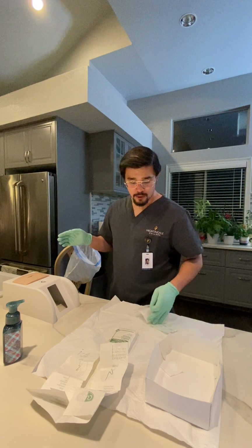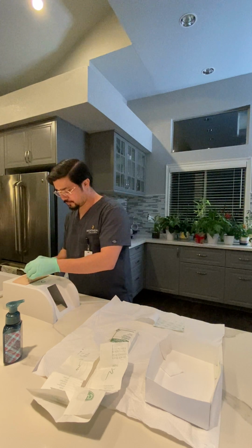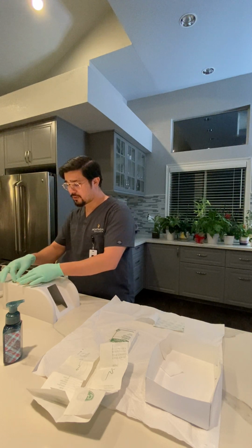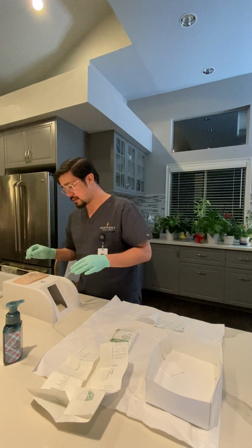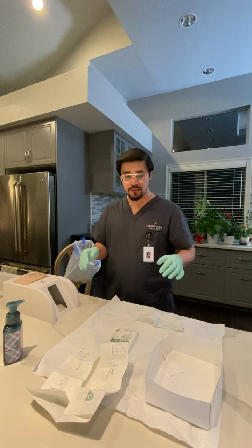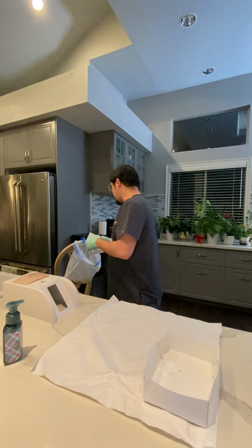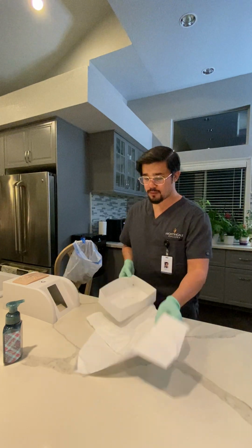I'm going to go ahead and open that. I'm now going to place this onto the wound. The actual Tegaderm has a border around it that I would then remove and throw into the biohazard waste bag. And once I've applied that to the patient, I can then begin to clean up the environment here, grabbing all the trash, throwing that into the biohazard waste bag, and cleaning up my space here.